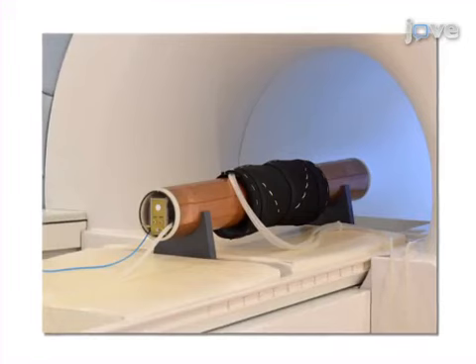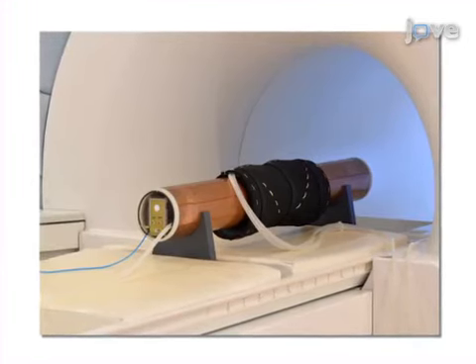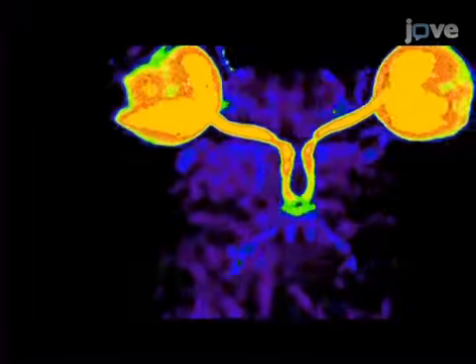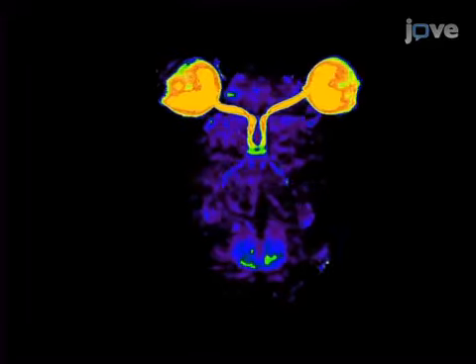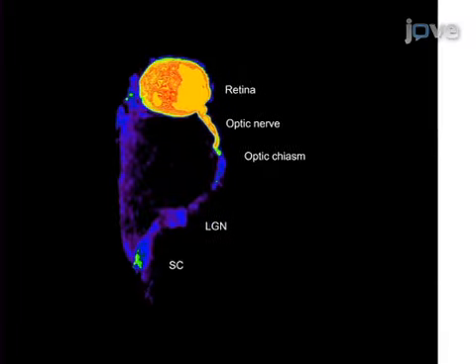The second step is to arrange the anesthetized mouse inside the 3T MR scanner using appropriate hardware for image acquisition and monitoring of vital functions. Next, the mouse-adapted and tracer-sensitive MEMRI protocol is run, and multiplanar 3D images of the intracerebral signal enhancement along the retinotectal pathway are reconstructed.